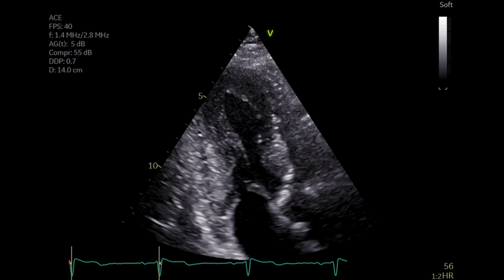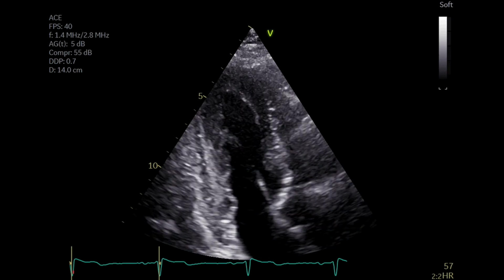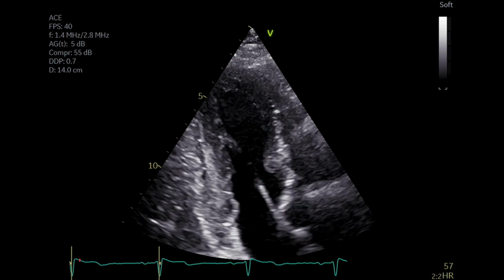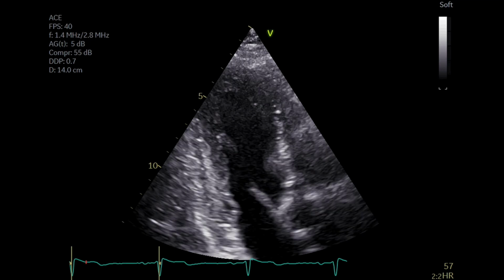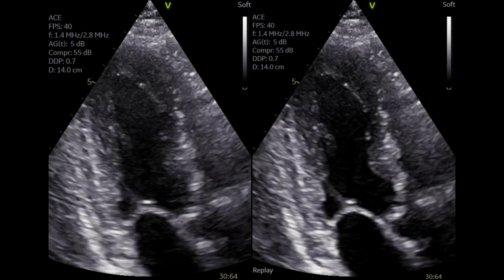In another example with very good effect of ADAPT from the study, we are alternating between the uncorrected and corrected image for the first 10 consecutive frames. The improvement in image quality is significant and shows how much ADAPT may improve images in a state-of-the-art echocardiographic system. Here is the cine loop of this specific case. The improvements from aberration correction are clearly visible in the right loop.